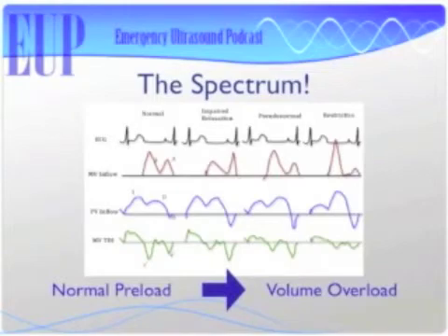So say I look at somebody's IVC, they've got a big dilated IVC, it's not collapsing very much, and they're hypotensive, and I'm wondering, should I give them fluid or should I give them pressors, right? Yeah. And then I take a look at their heart, and they've got impaired relaxation. That tells me I can probably push them a little bit further, and I can give them some more fluid and keep pushing them until that E wave reaches the height of the A wave, and I'm pushing them just to that tip of pseudonormal, right? And at that point, I know that I've got their LV-EDP up high enough that they should be responding well to the fluid. And if they're still hypotensive at that point, then that's when I'll start pressors.